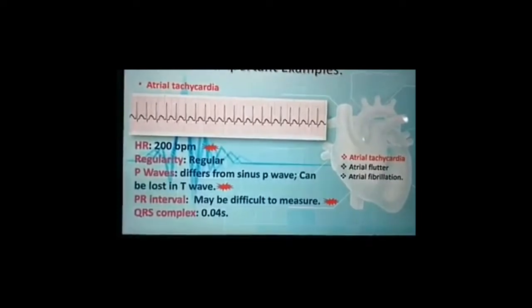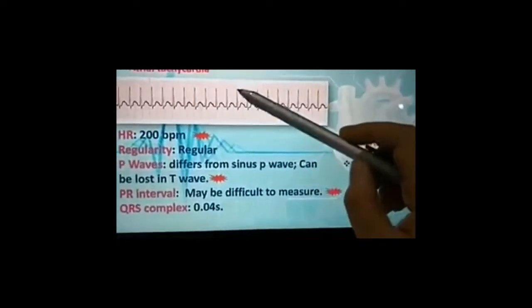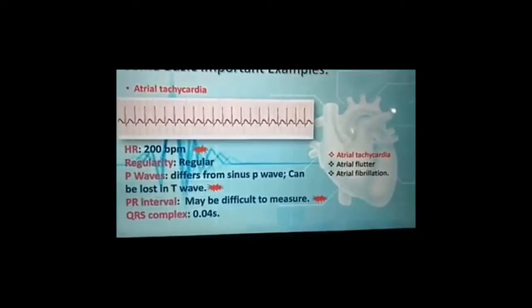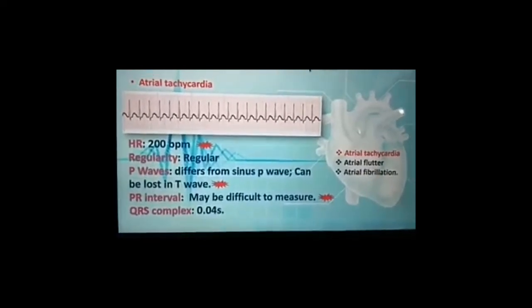PR interval may be difficult to measure. The PR interval, from here to here, may be difficult to measure because we cannot define what the real P waves are.